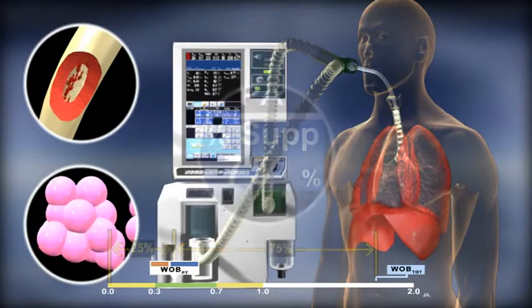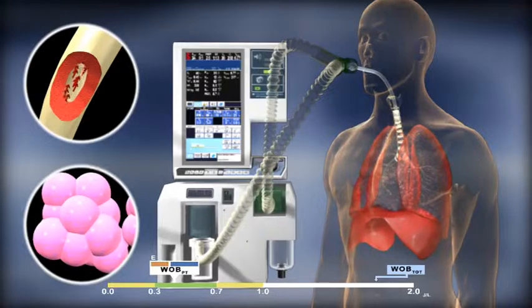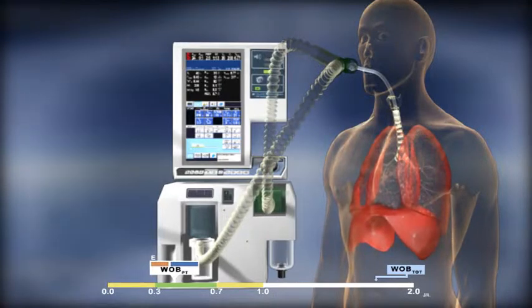In addition, as patient demand or inspiratory flow rate and volume change from varying needs, PAV Plus measures these needs and changes the delivery support in response within the same breath to try and keep the diaphragm in an optimal environment. It is all of these measurements working in harmony to constantly assess areas of work that a patient may experience and changing the delivered pressure on a breath-by-breath basis that keep the patient in a reasonable work environment.